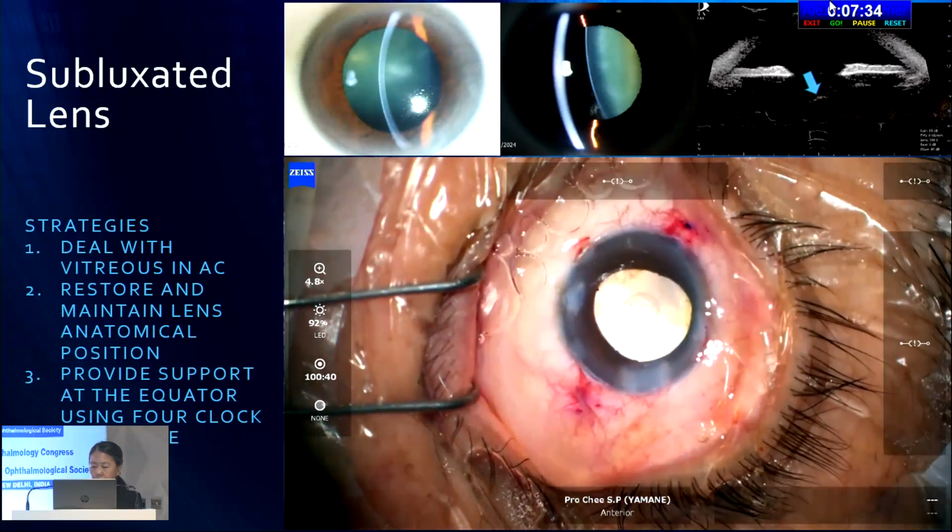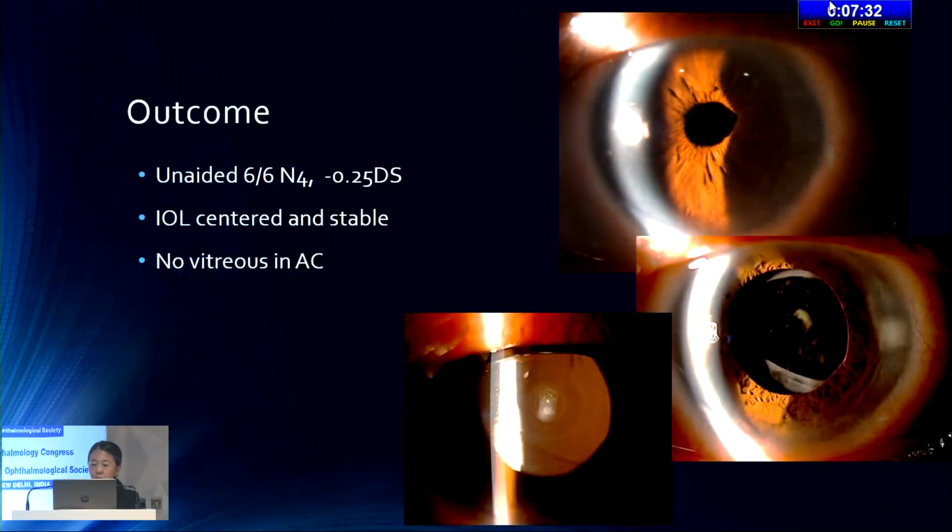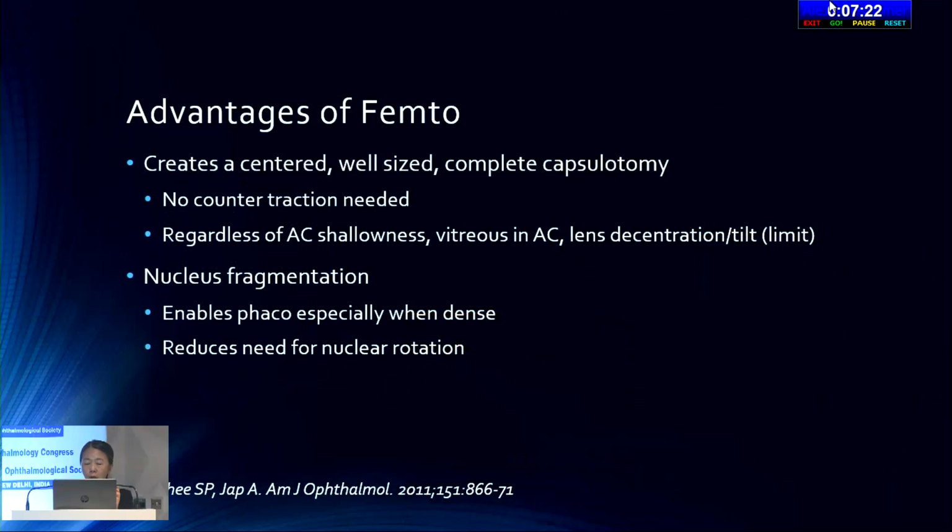And you can see this is the EDOF lens, and how did this patient do? You can see the refractive outcome, and you can see also the centration of the IOL. This patient did very well. Okay, so we go on to femto cataract.